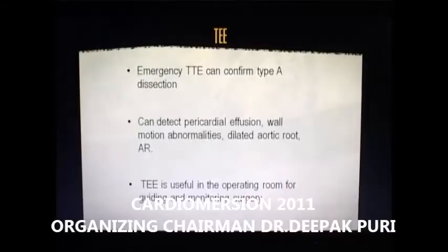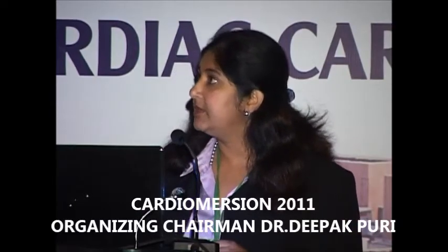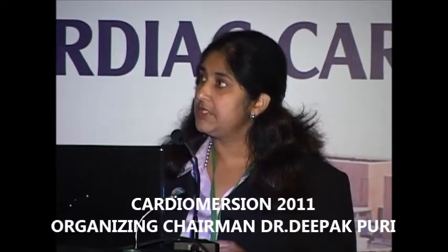The most important thing is that when the patient is crashing and you cannot take them to the CT suite, at that time TEE comes in very handy because it can be done right on the operating table, and real-time imaging can be obtained. This is an example given to me by one of my cardiologists.